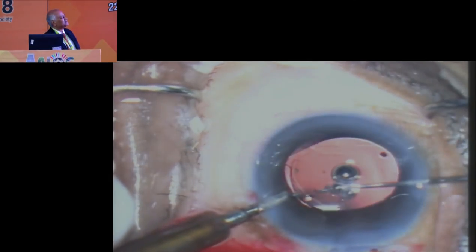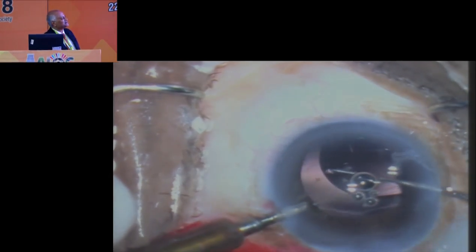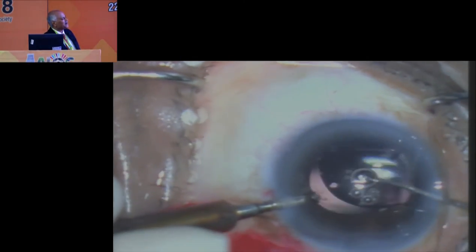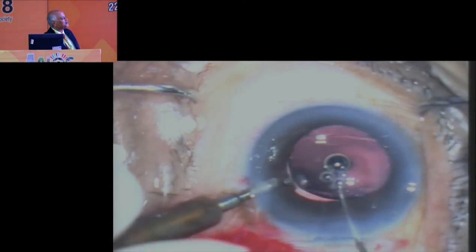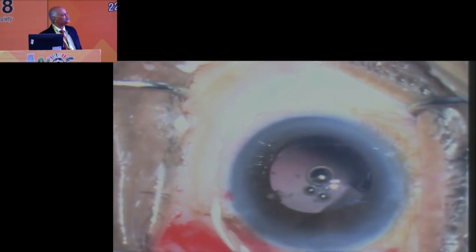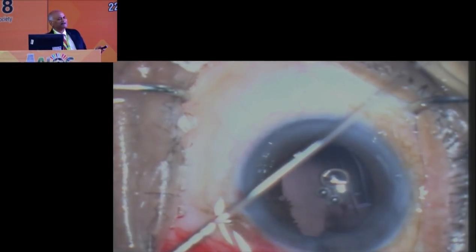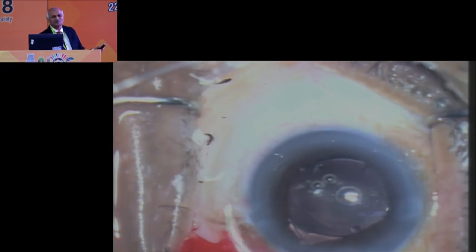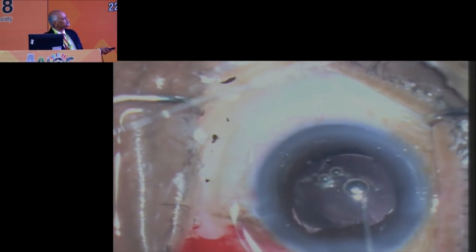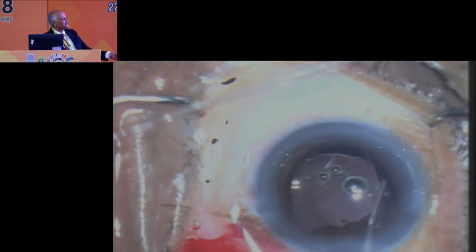And then now again I want to show you, there is an excellent rim of this one. I am going to put a PMMA IOL, can you see this? I was rotating. So what I was telling is, once you are rotating the nucleus, this lens goes down. So here once the lens goes down, again I have caught that lens. That was my luck, nothing more than that, because it was a proper vitrectomy, the lens was there, and so I was able to do that.